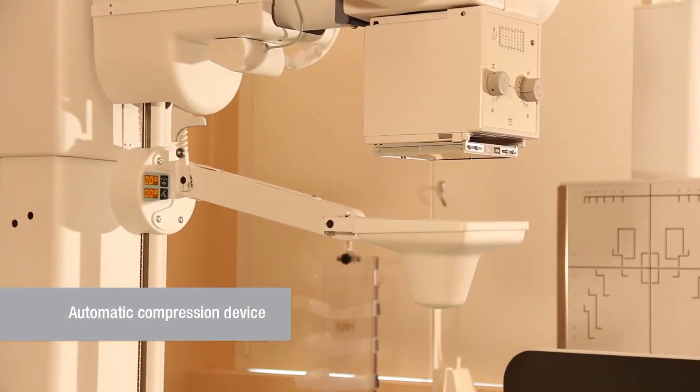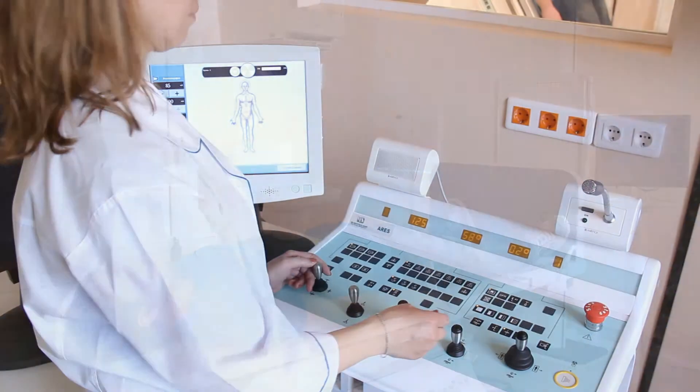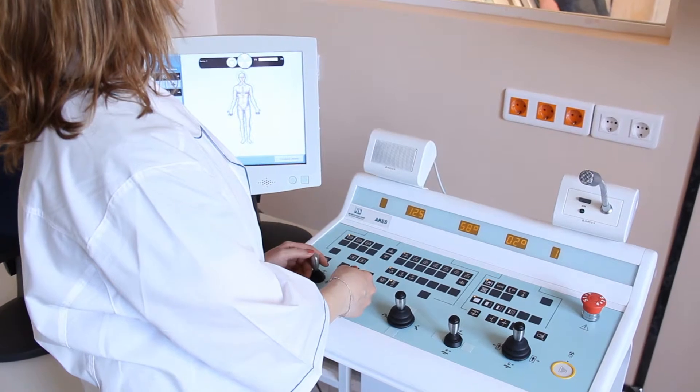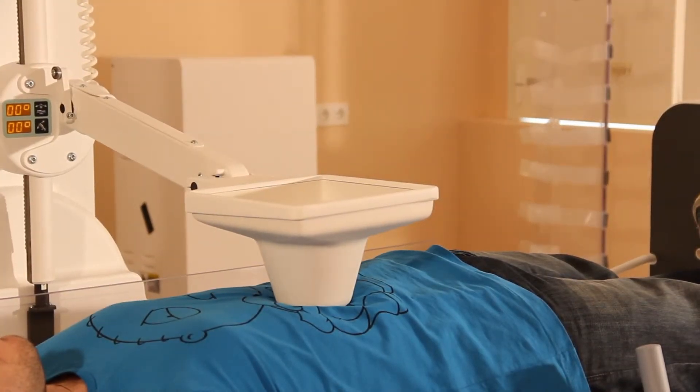Automatic compression device allows carrying out detailed examinations without any assistance. Remote compression system technology automatically calculates the pressure force based on the patient's body size and guarantees patient safety.